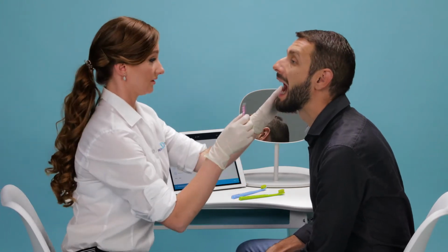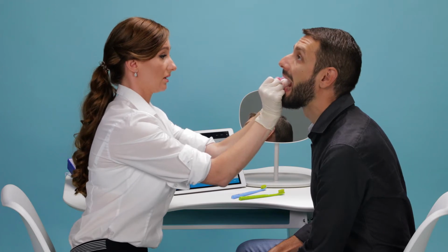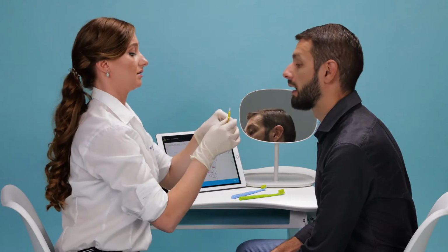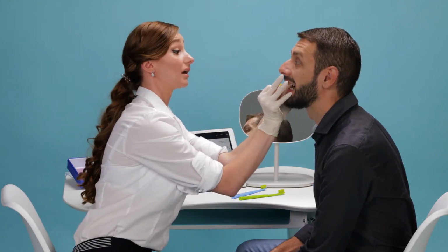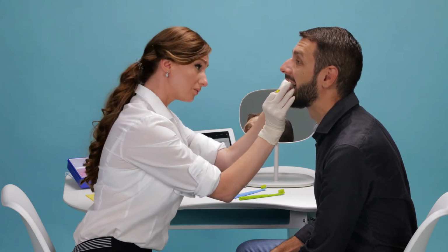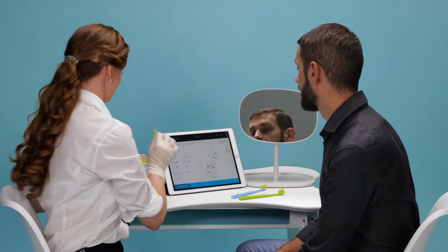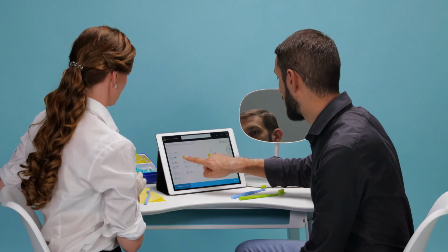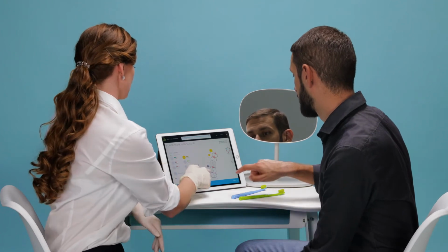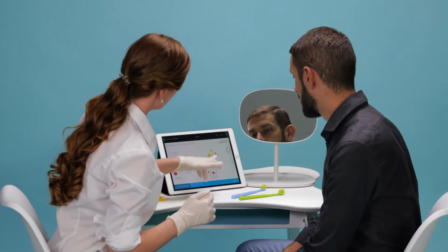I continue with the pink prime brush, as this is the brush from the last session. However, today it is now possible and appropriate to increase this brush size in this area to that of the yellow prime. Edward inputs his new colour into his score and the bleeding sites present. A notification also reminds me that I have now input 3 or more aids and questions, is my patient confident and competent to use this quantity.